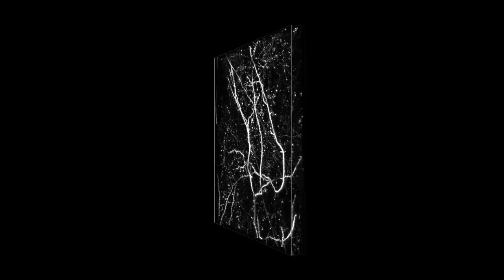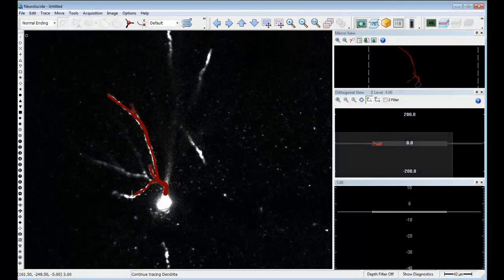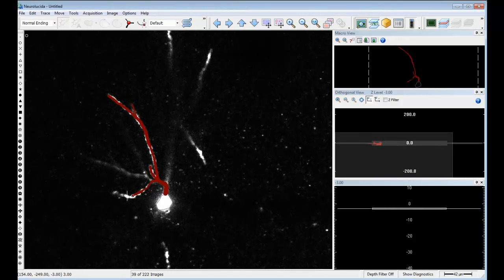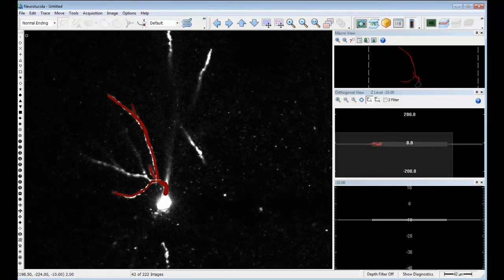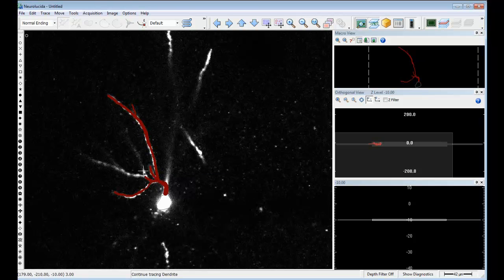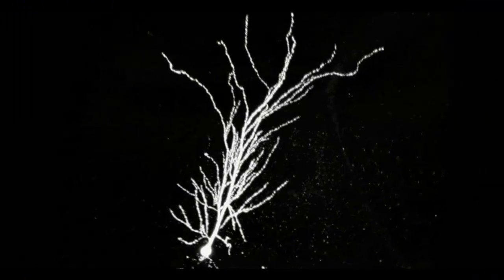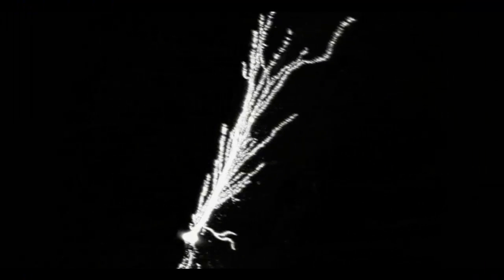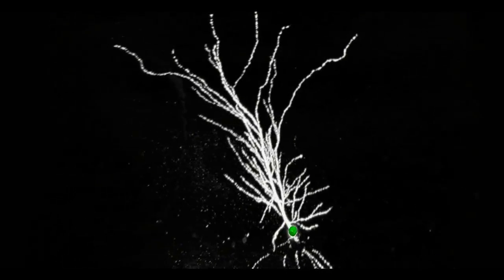When combined with Neuralucida, the Virtual Tissue Extension module makes it easier to trace neurons at high magnifications. The 3D whole slide image is acquired automatically, allowing you to begin tracing neurons immediately after the images have been acquired — no need to manually line up or stitch images. To save even more time, transfer your 3D whole slide image to a workstation with AutoNeuron for automatic neuron tracing.